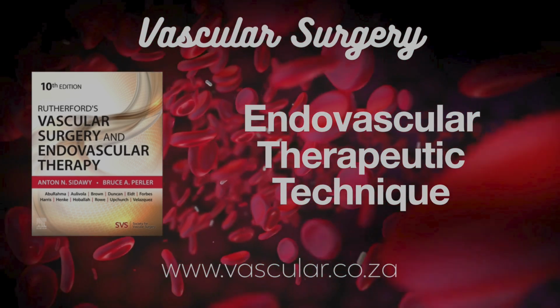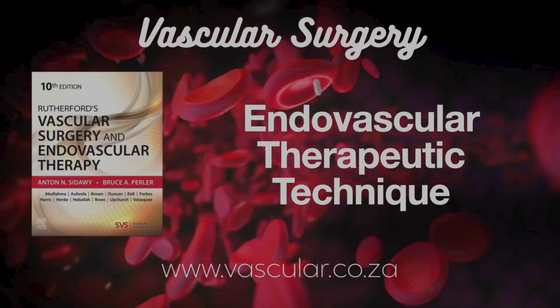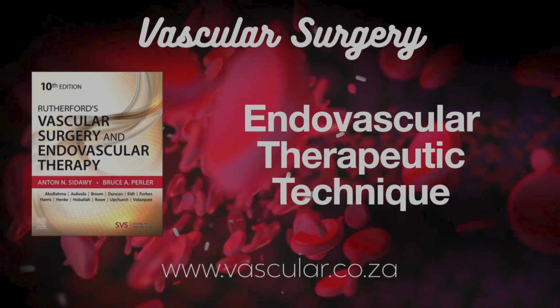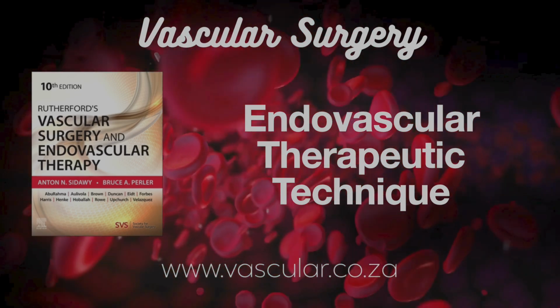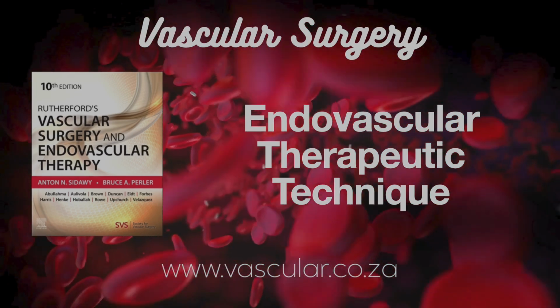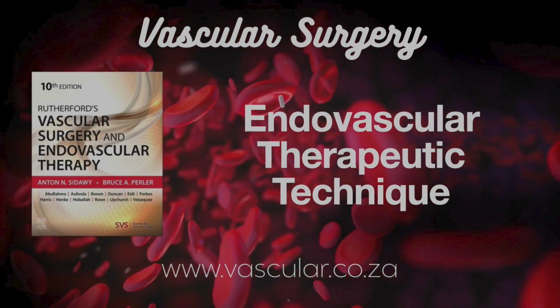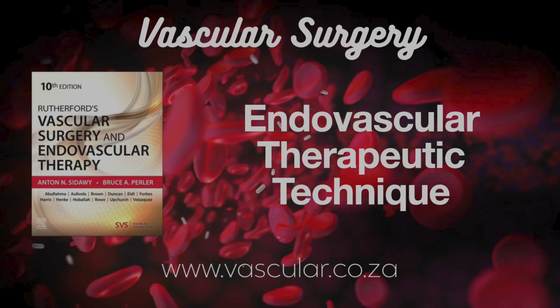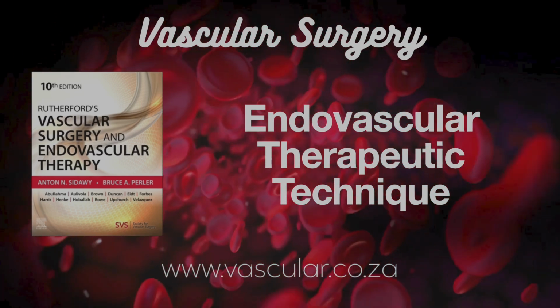Next up, cryoplasty. Sounds cold. It is. Cryoplasty combines balloon dilation with cold thermal energy. They inflate a special balloon with liquid nitrous oxide, chilling the lesion down to about minus 10 degrees Celsius during dilation. And the theory behind that? The theory was that the cold might reduce that problematic cell overgrowth, the myointimal hyperplasia, which causes arteries to re-narrow. Hopes were for better long-term patency without needing a stent.